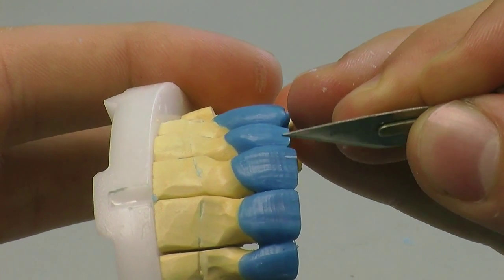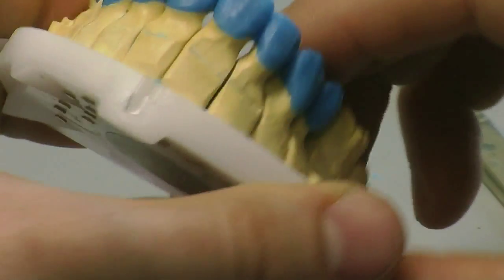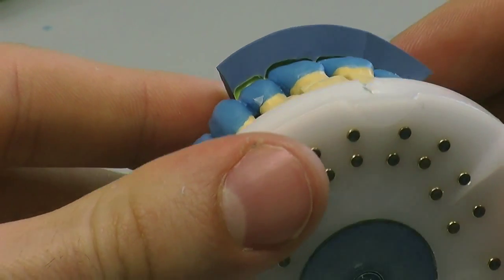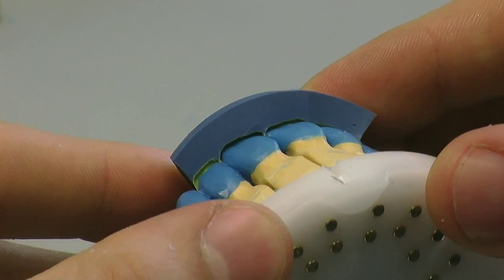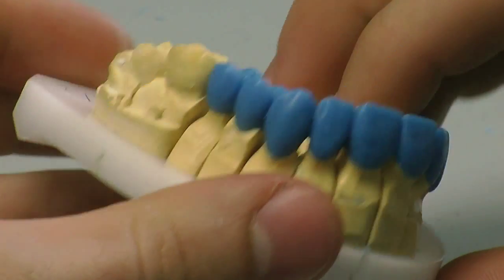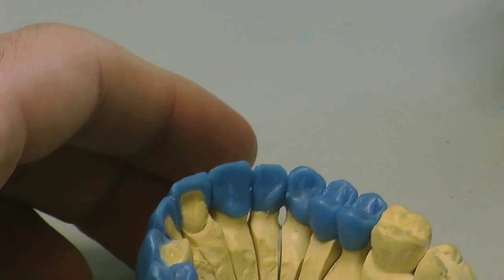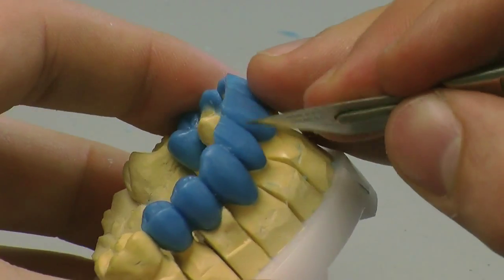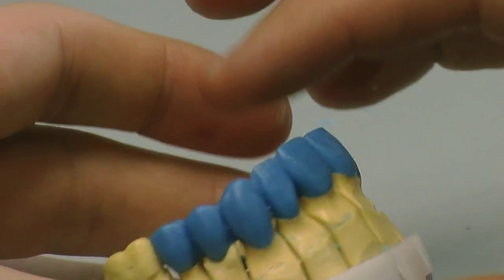So we're just finishing off the incisal cut-back now and we're going to be verifying that with the putty for the final time any moment now. We just need to make sure that we've got enough room for the ceram porcelain which we're going to be layering over the whole labial surface — about 0.5 up to a millimetre. So now we've verified our occlusion, our fit's really good, our protrusive is good, our left and right lateral is good. So now what we're going to be doing is we're going to be splicing through the wax-ups, cutting through and preparing the margins for the individual investing for the pressing process.